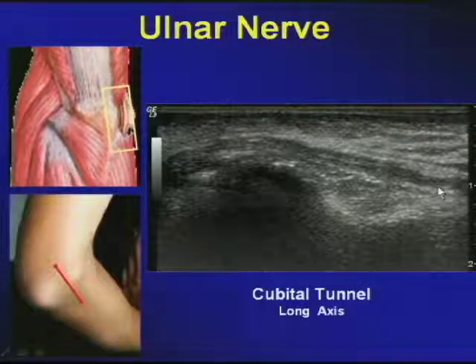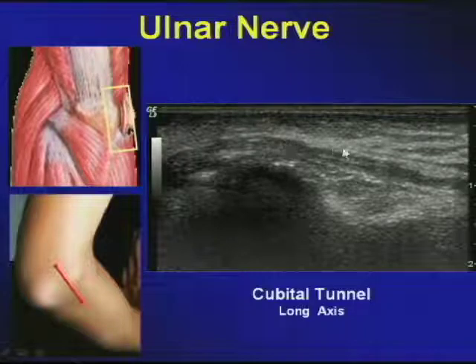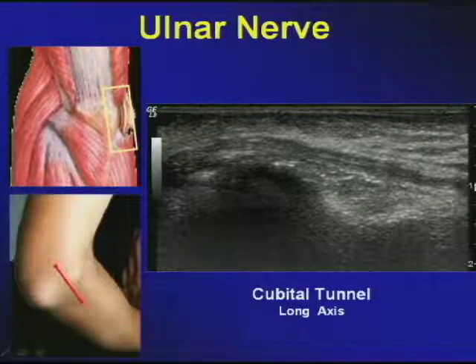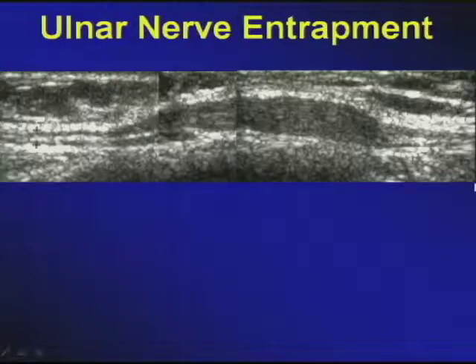Note that it's got 3 lines, so it does look like a rail track in this individual, and extends from the supracondylar portion into the cubital tunnel proper into the distal portion of the ulna. The diseased ulnar nerve can be appreciated in this example, wherein within the cubital tunnel you have the fusiform hypoechoic swelling of this nerve. Note too that in the supracondylar portion it maintains a tram track appearance as it enters the cubital tunnel, and likewise the unaffected distal portion, where again it resumes its fascicular or tram track pattern.